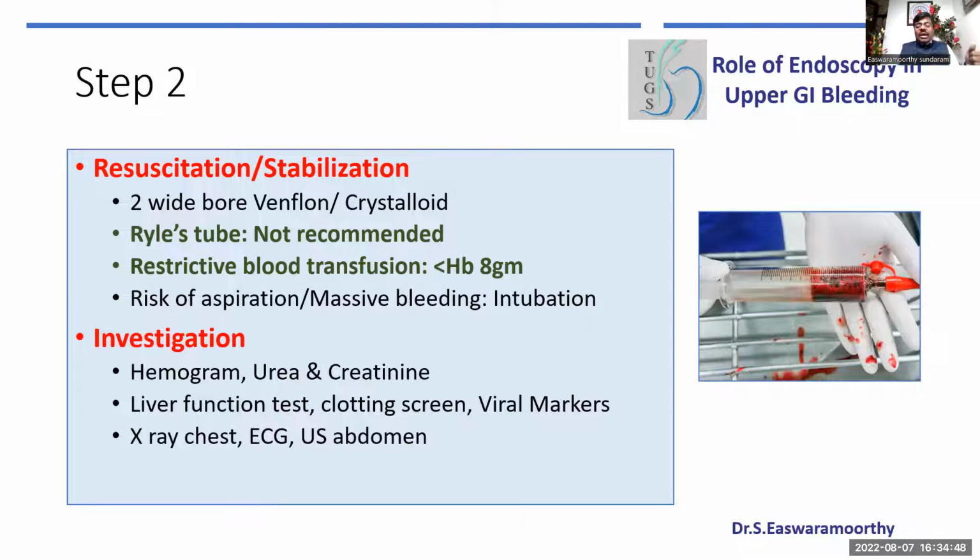And of course, we need to get the viral markers ready. Universal precautions apply when you are doing any procedure for that matter. And the chest X-ray and ECG; in our algorithm, bedside ultrasound is ideal to know about the liver, splenomegaly, portal vein, or any other exciting or interesting causes you can find.